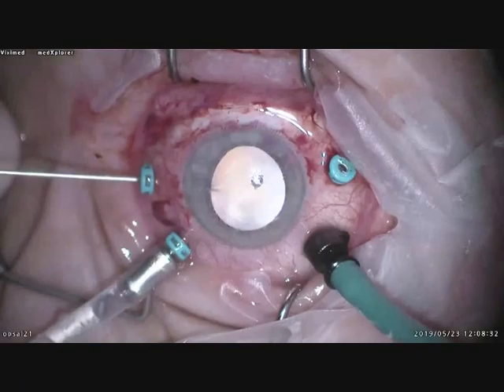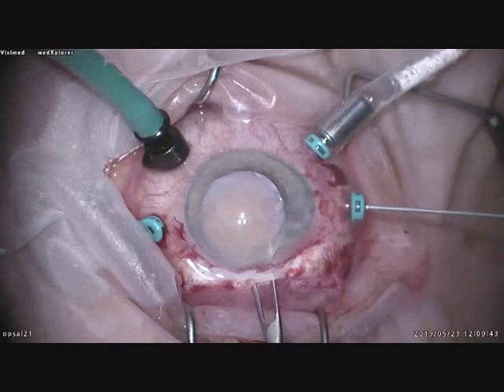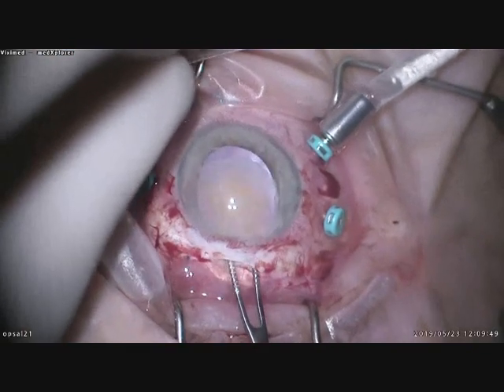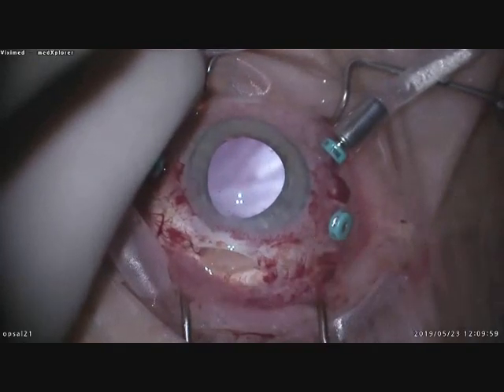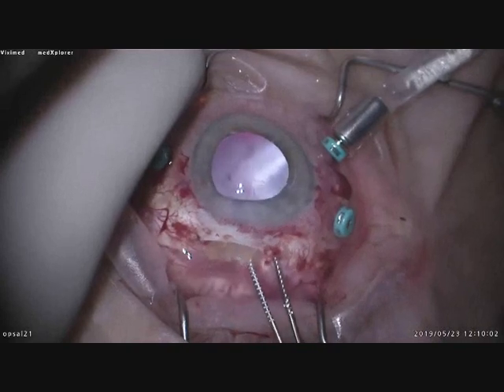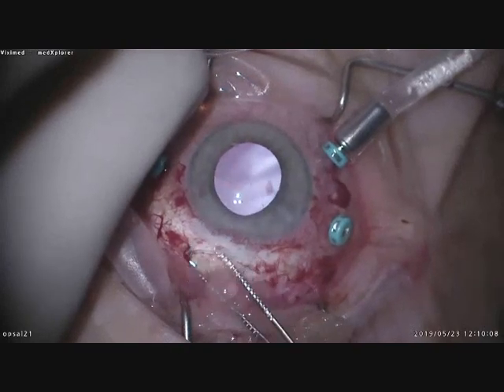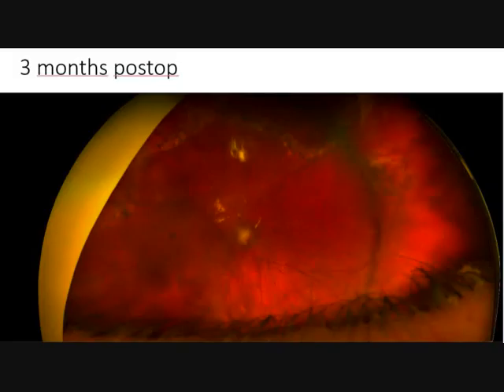I'm aspirating with the vitreous cutter, elevating the nucleus up to the pupil. Extraction loop. And now extraction. And I'm lucky this time. The nucleus is removed. And I can start with the second part, which is retinal detachment surgery. I did encircling band, vitrectomy, laser, silicone oil, and 3 months post-op the retina is attached under silicone oil. You also see the encircling band.